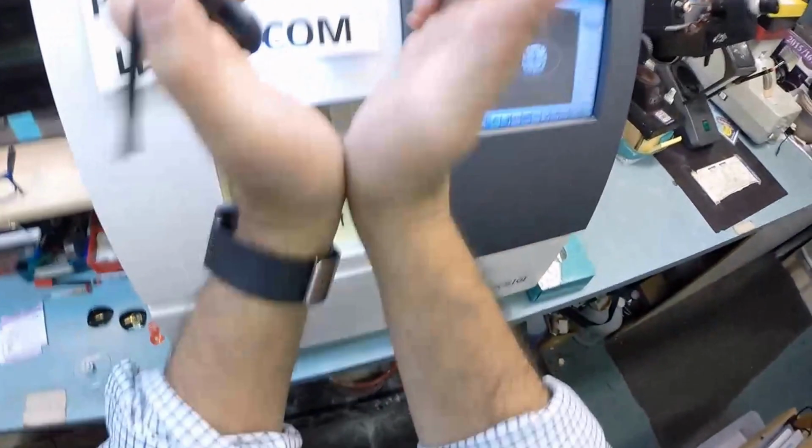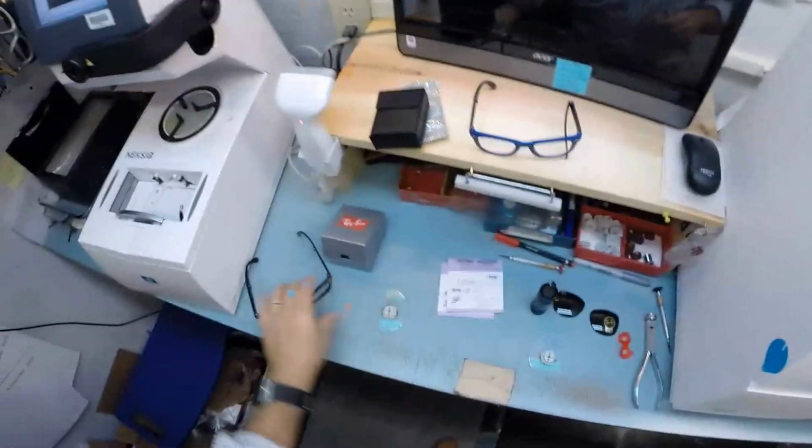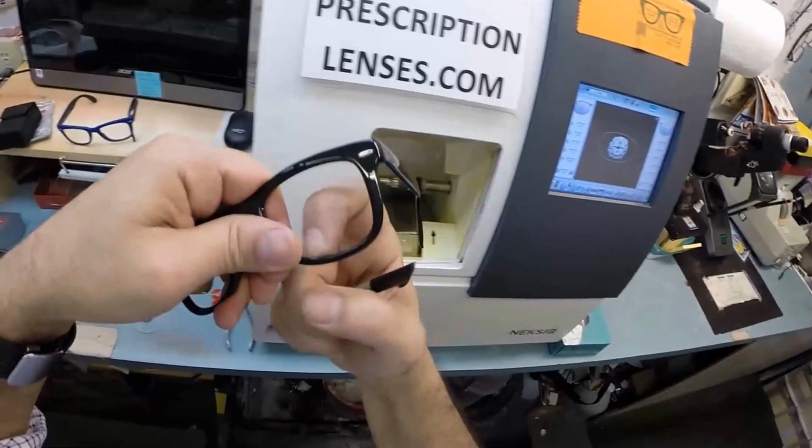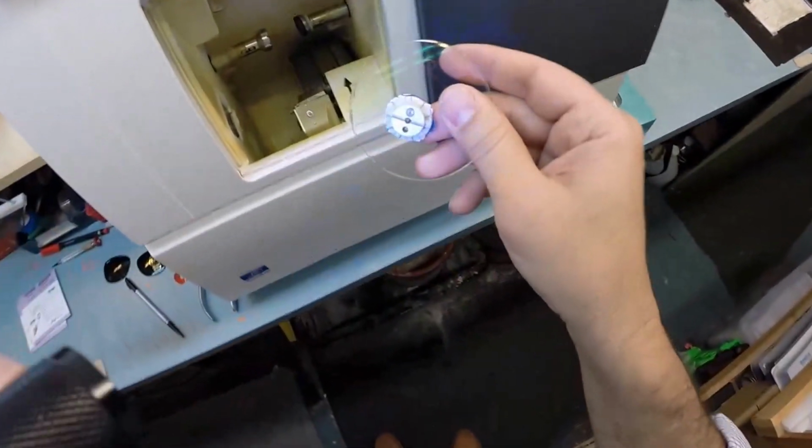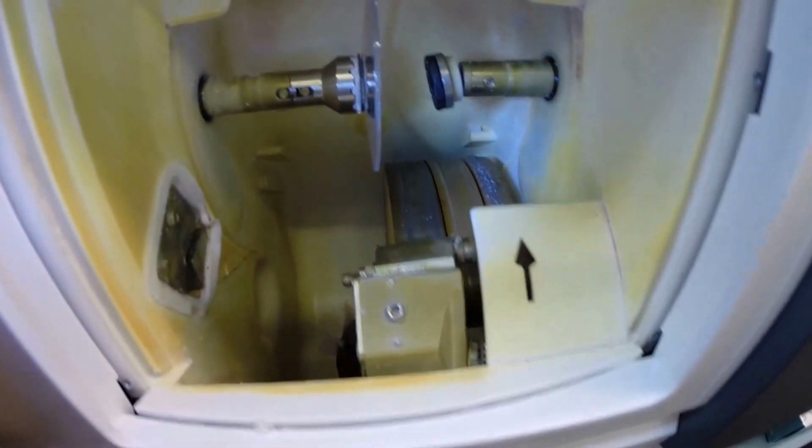This wheel in the center, that channel, that little valley, that's what's going to put the V-shaped bevel onto the lens, so it stays inside the bevel of the frame. So I'm going to go ahead and let the magnet do its job a second time right now. It's going to hold it in place into the chuck, or as I like to call it, the Charles, because I don't know this machine well enough to call it chuck.